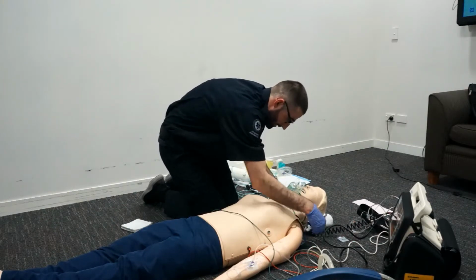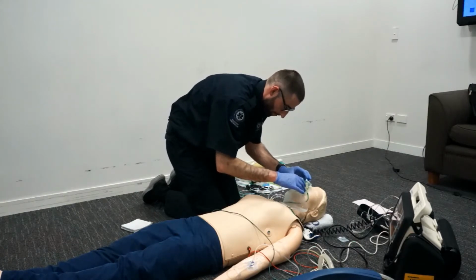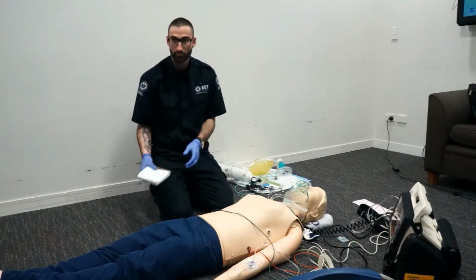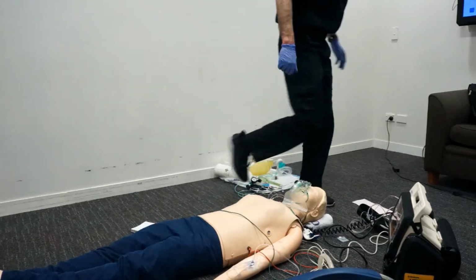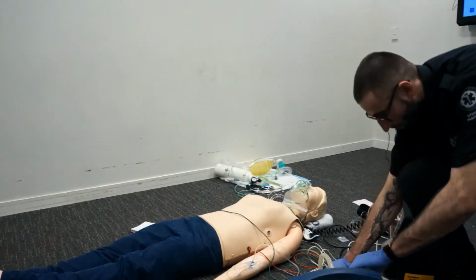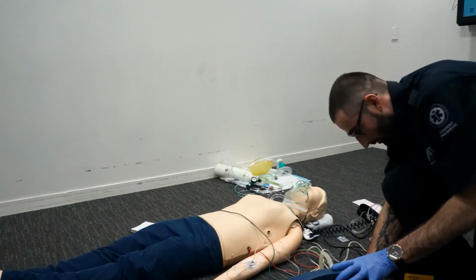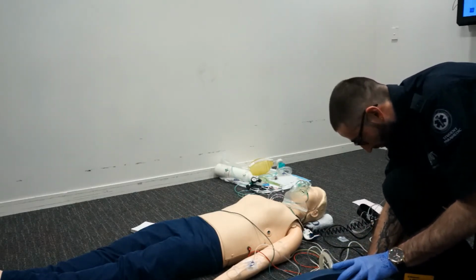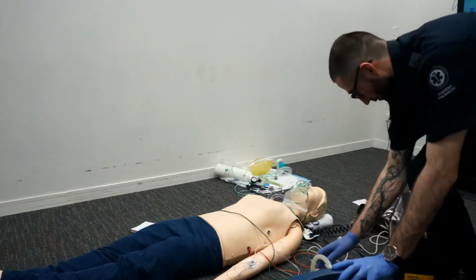Placing that under the head and leaving it unattached. Ensure suction is working and turn it off. Okay. Turn it on and testing. Okay, that's working and it's turned off.